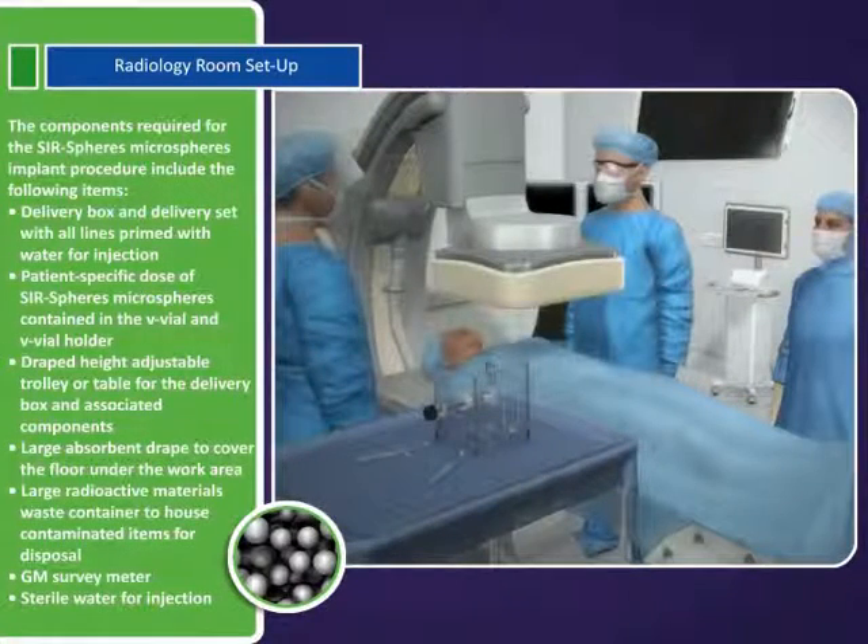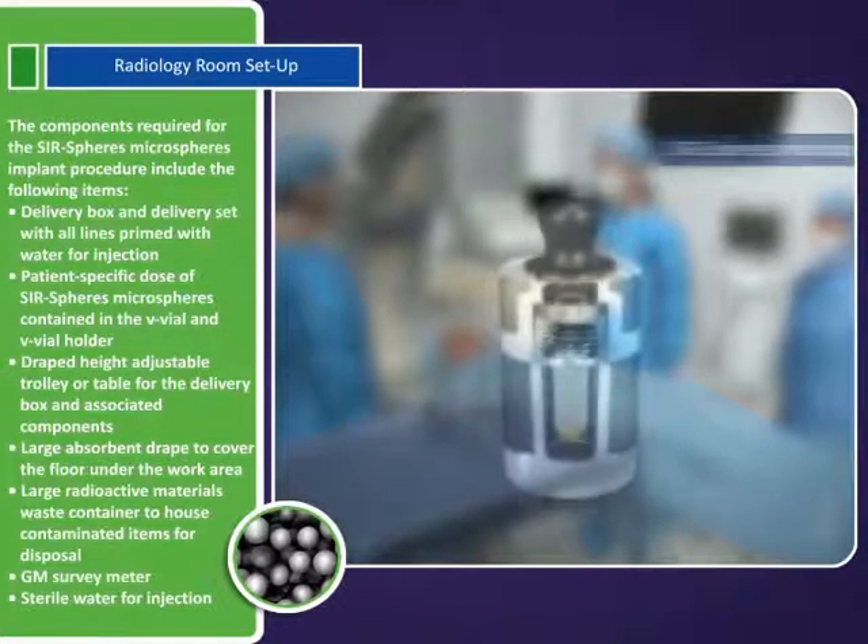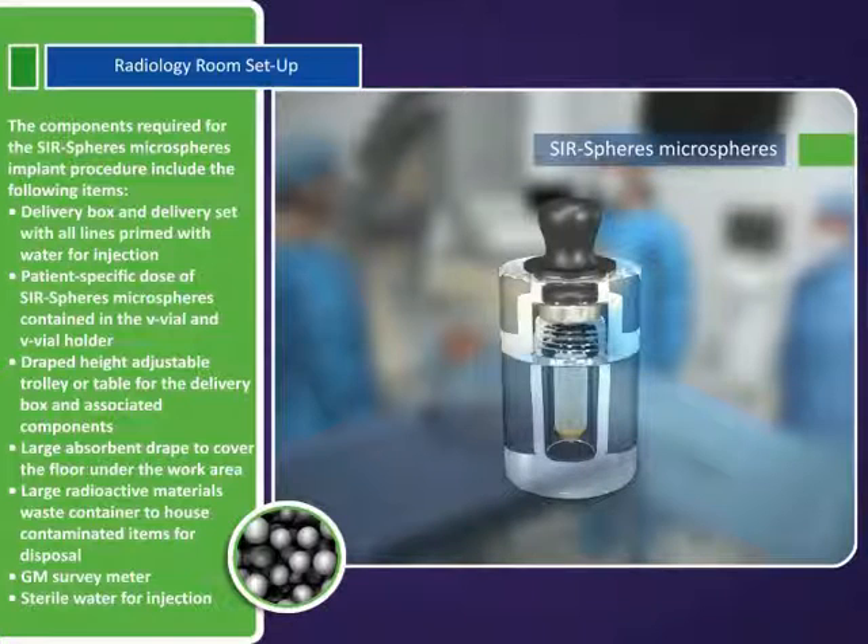The components required for the SurSpheres microspheres implant procedure include the following items: delivery box and delivery set with all lines primed with water for injection, and the patient-specific dose of microspheres contained in the V-vial and V-vial holder.